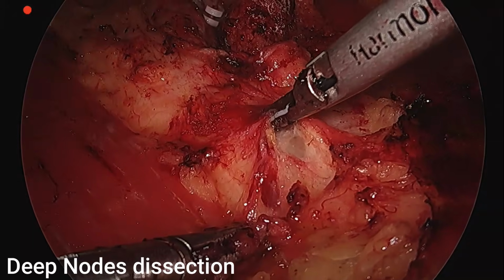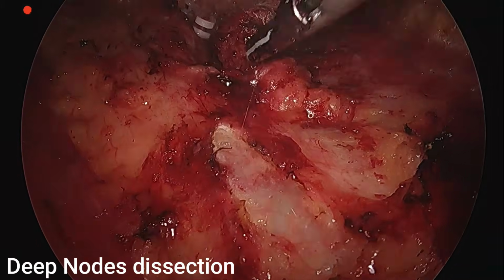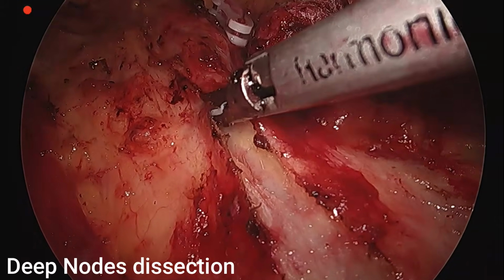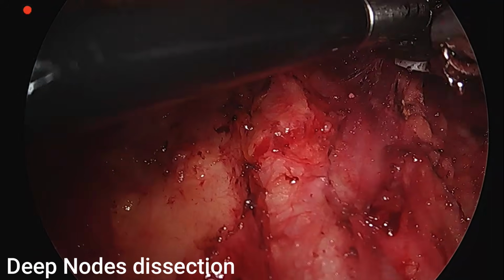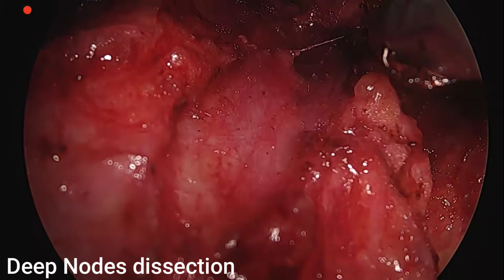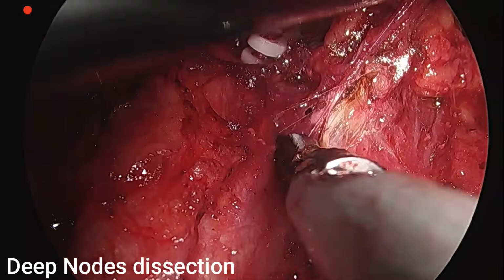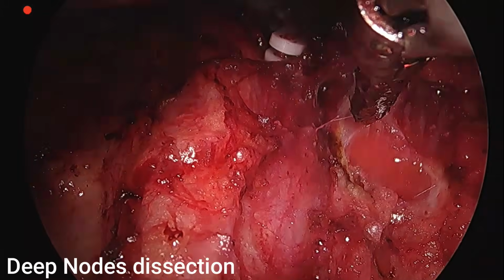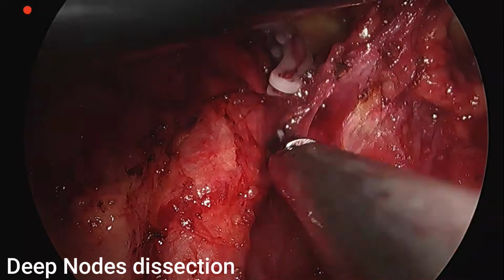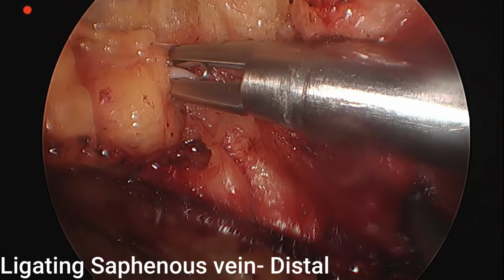So we start our dissection of the deep nodes from the apex of the inguinal ligament, leaving the fascia over the iliacus, which covers the femoral nerve. So we walk along the femoral artery, leaving the fascia laterally. Now after removing the nodes over the femoral artery, we shift our focus to remove the nodes along the femoral vein up to the level of the Cloquet's nodes, deep nodes up to the femoral ring. So once these deep nodes are removed, the deep node dissection is completed.